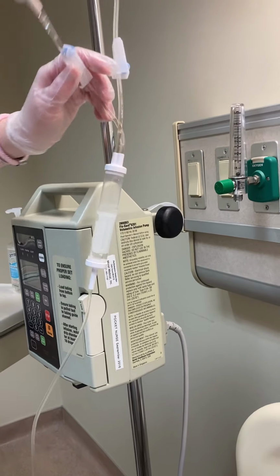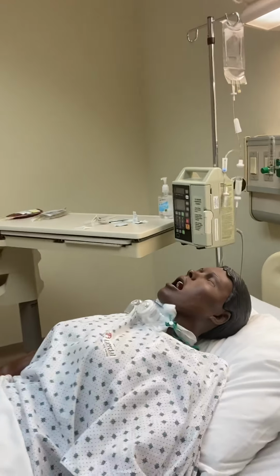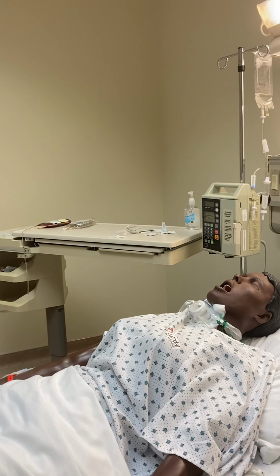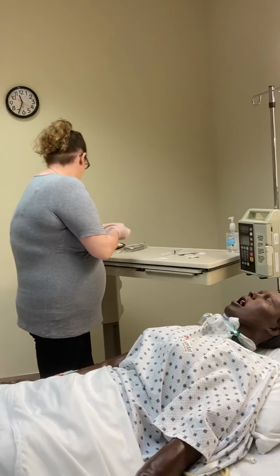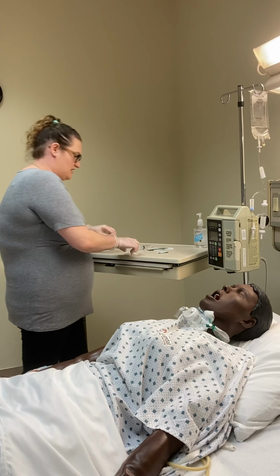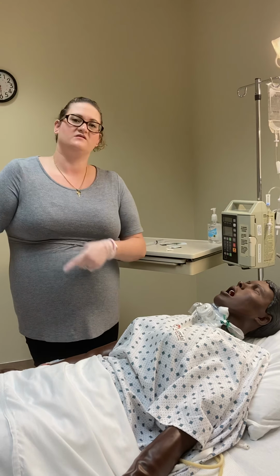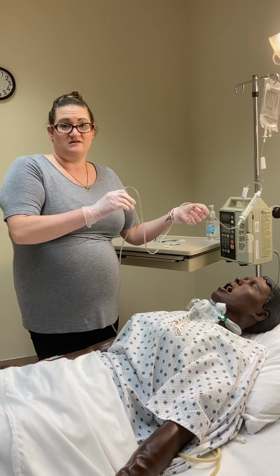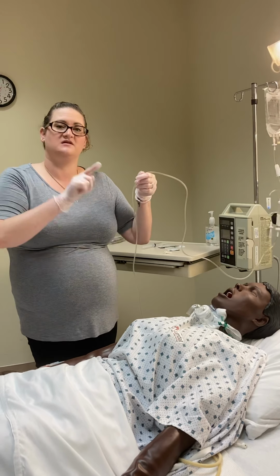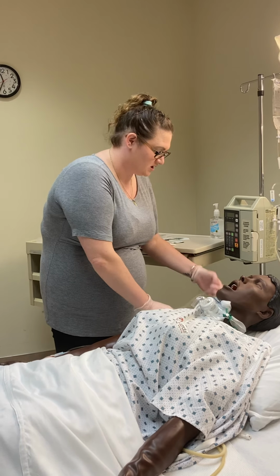Okay, we'll say that we've got the 5 drops in a minute. And now I'm gonna go and get the blood. Basic rule of thumb is that you have 30 minutes from the time that you get the blood from the blood bank to get it infusing into your patient. So that's why having the KVO is nice, because it's gonna make sure that that IV stays patent while you go and get your blood.